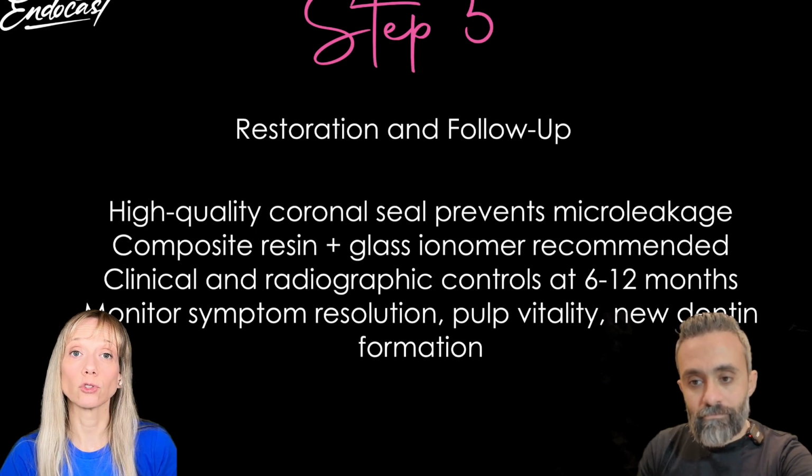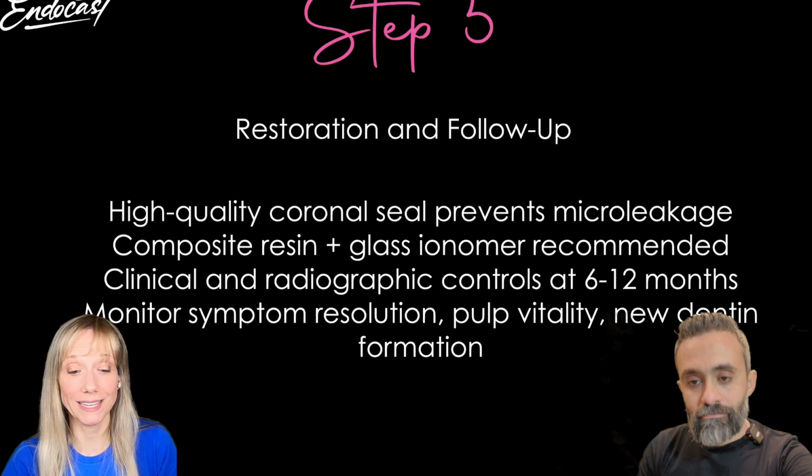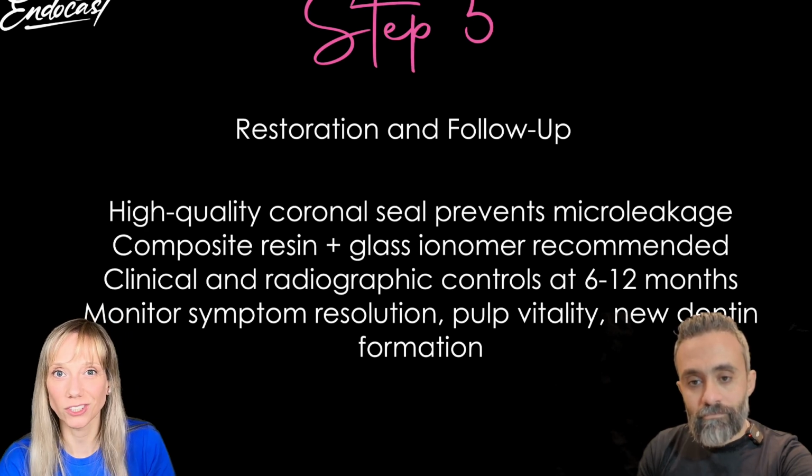And how do we follow up? Well, we do clinical and radiographic controls, as we do normally with the endodontic treatments.